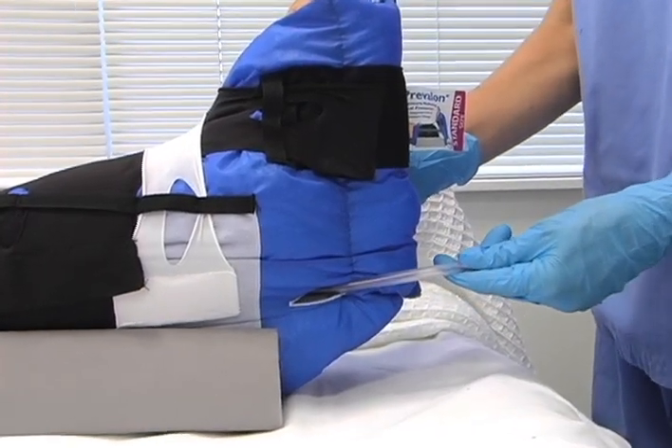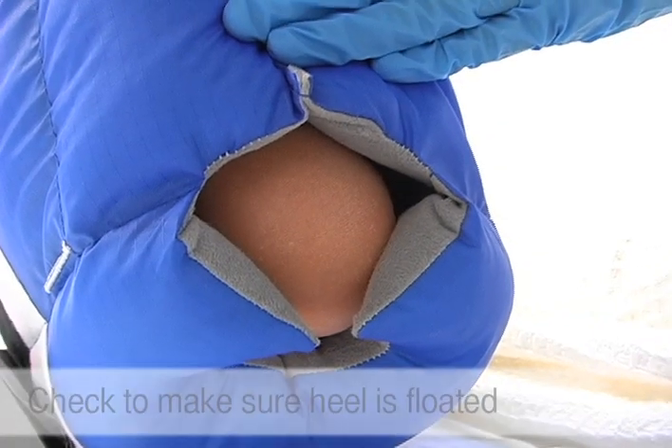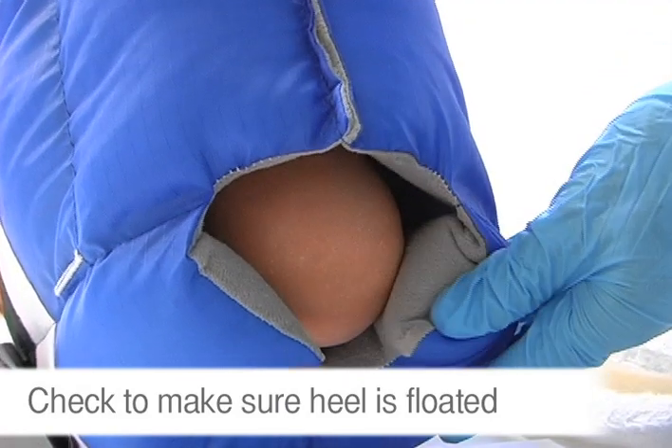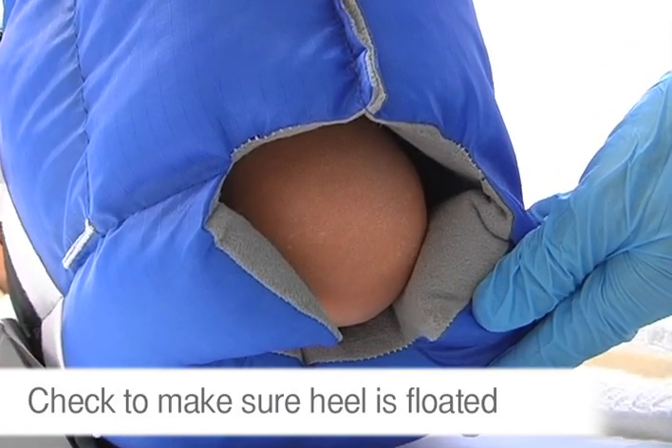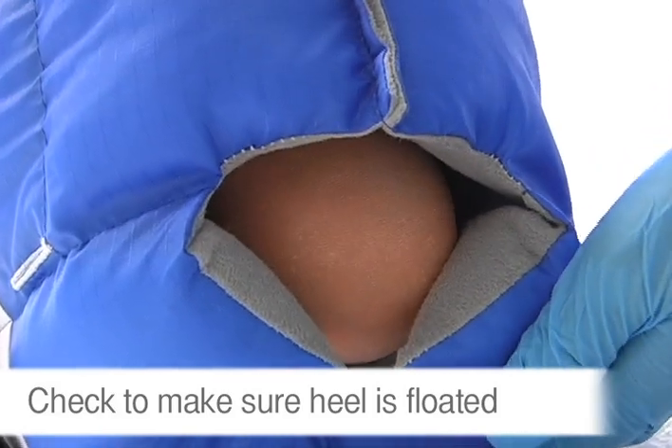Eliminate any slack in the tubing by tugging gently. Finally, make sure the heel is floated. Check by looking or feeling in the opening at the bottom of the boot. If the heel isn't floated, reposition the heel and readjust the stretch panels.